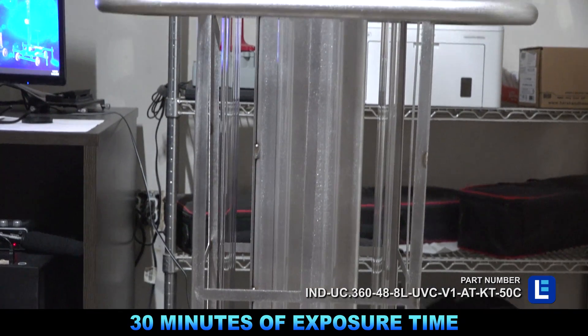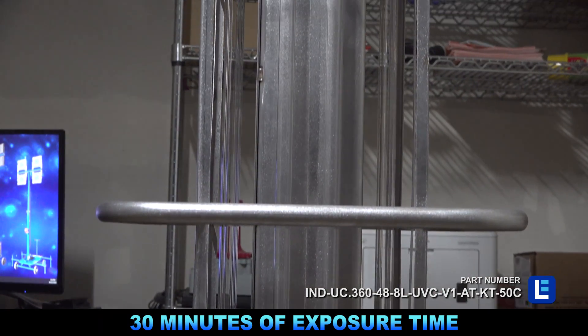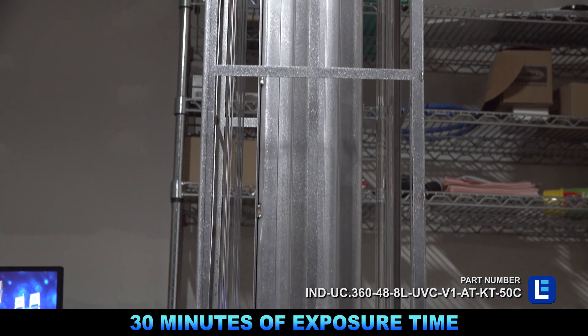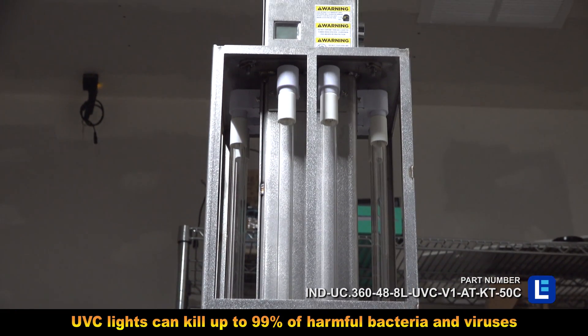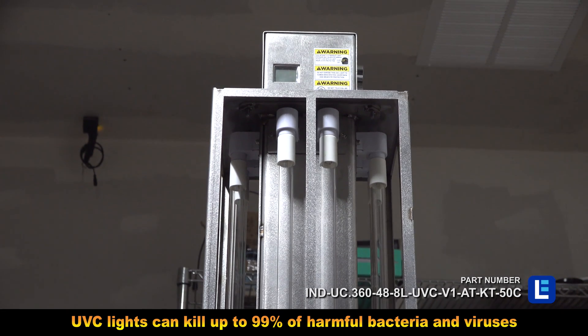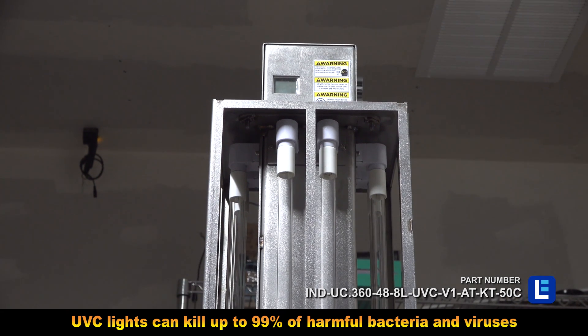With a recommended 30 minutes of exposure time for viruses, multiple carts can be purchased to cover larger areas more quickly. The UV light can disinfect over 99% of bacteria, viruses, mold and spores.